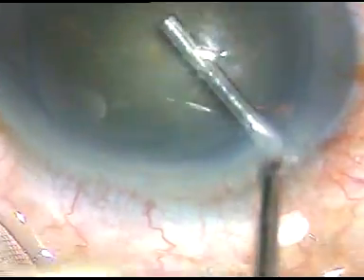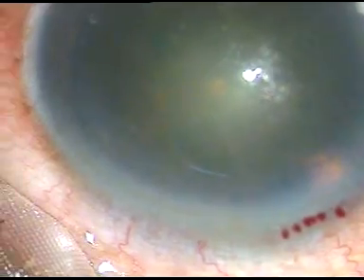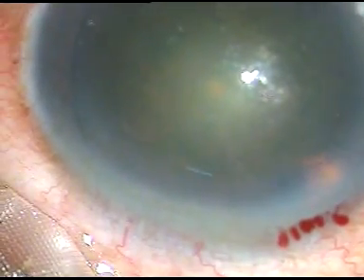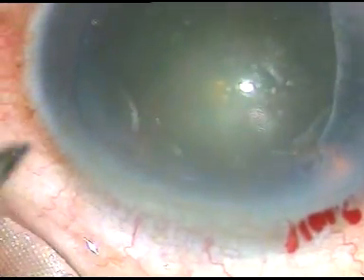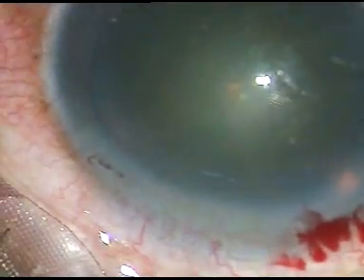This is a viscoelastic substance. In this case, I am going to use only one side port and I am going to use the Simcoe cannula, not manual. This is the side port on the left side of the main incision, which will be used for the chopper.